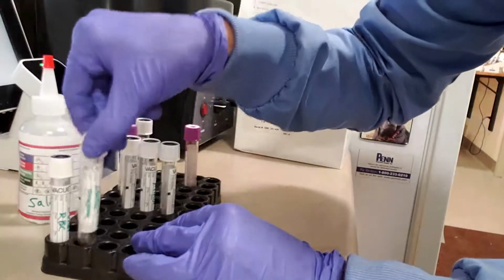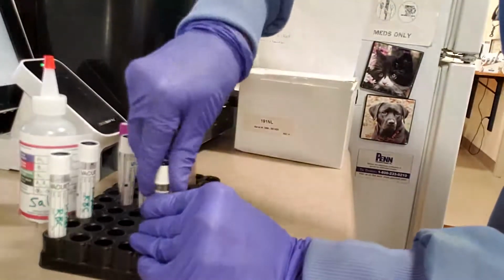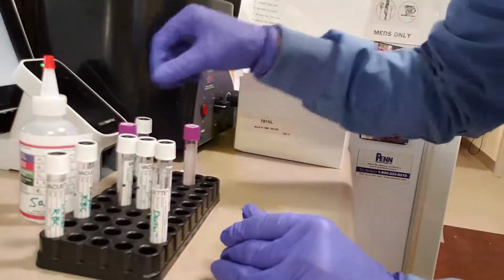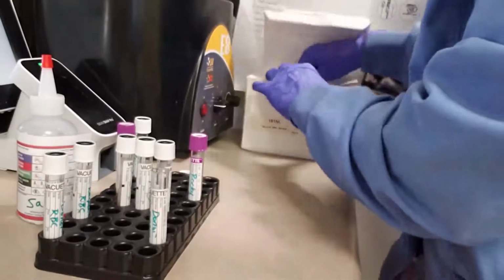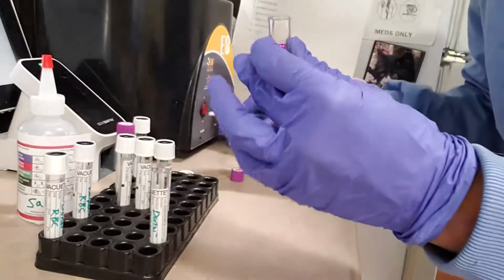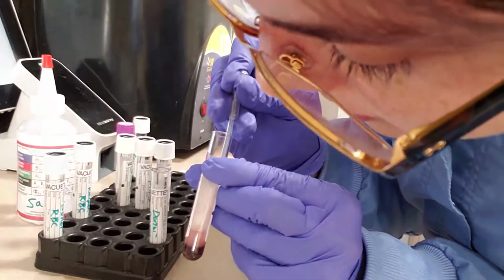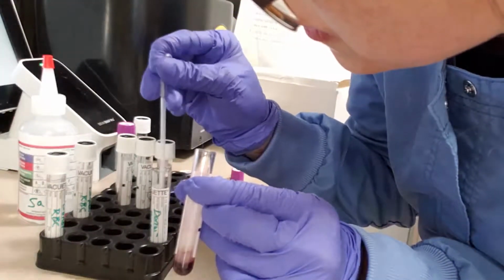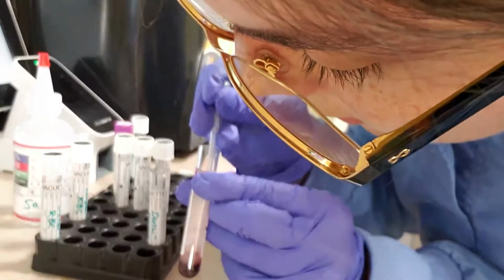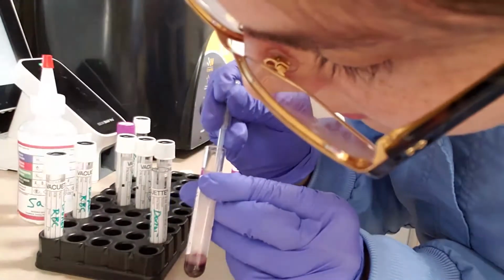So now our plasma is ready for when we get to that step. So put that there. And then next, we want to get our donor plasma. So we'll have that ready. And we have our donor sample. Get our fresh pipette. And again, we very carefully want to get that plasma without disturbing our red blood cells. We're putting it into a clear, non-additive tube until we are ready for it.